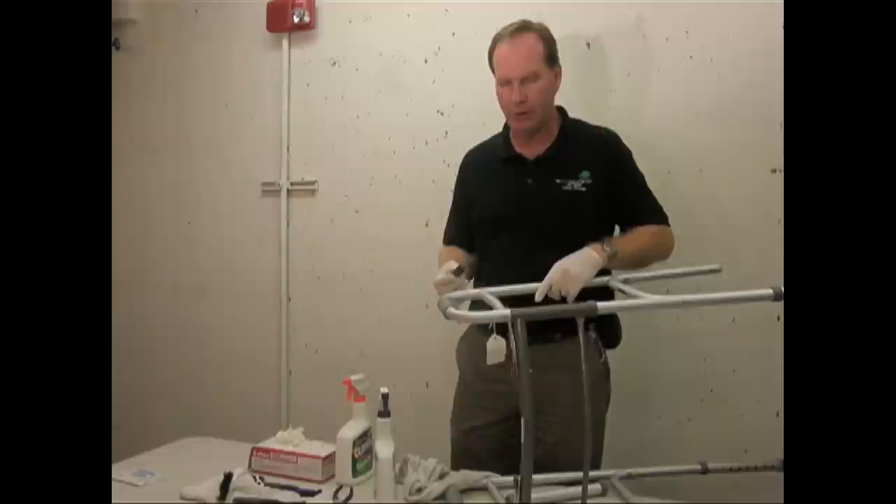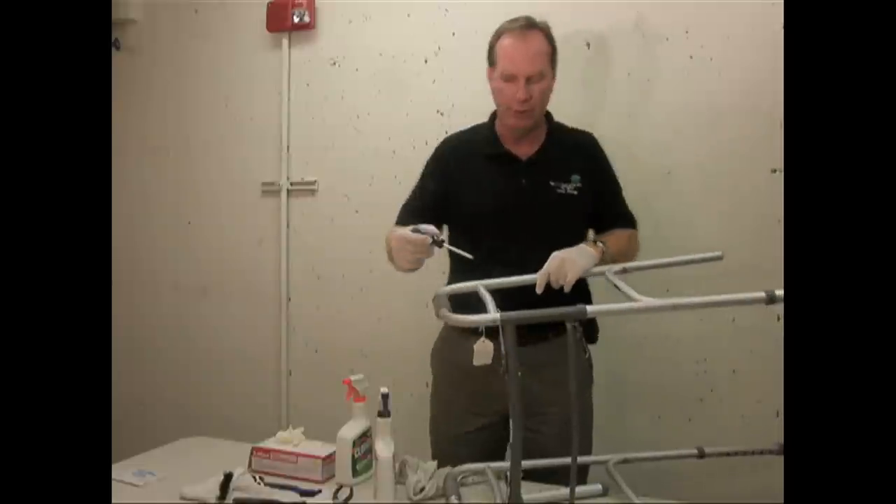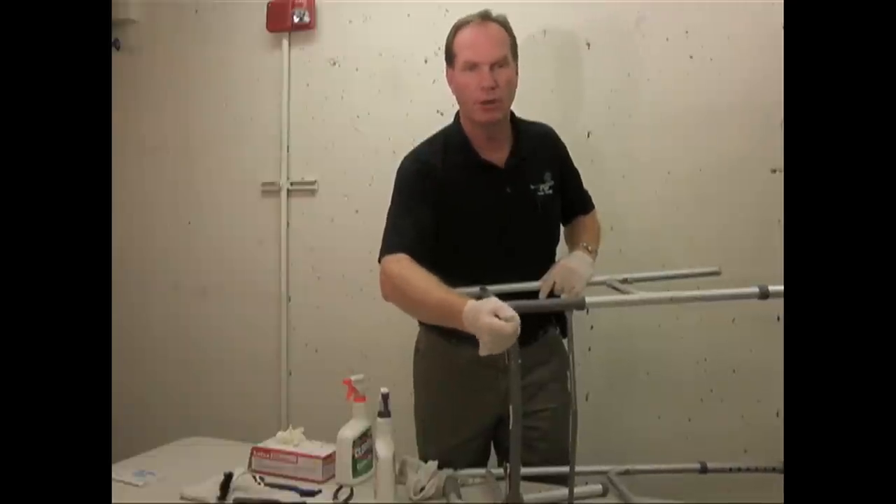After it's all clean, go around making sure that all the screws are tight. Anything that was assembled — make sure they're all tight, there's no wobbling, no creaking or squeaking.